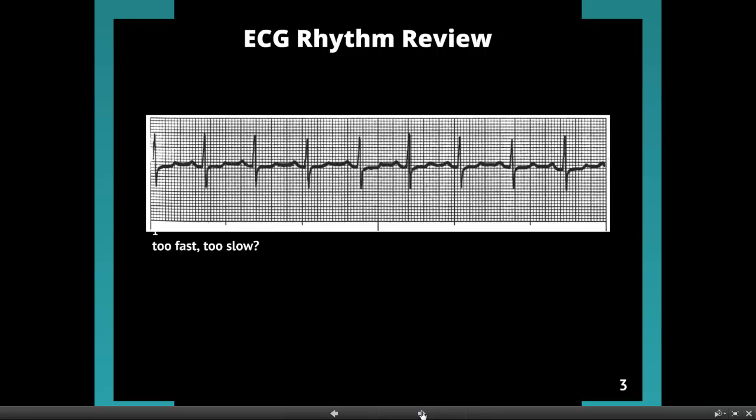Step number one: is it too fast or too slow? We're going to be looking at the QRSs — how far apart are they? These seem to be equally separated. We're going to use our 300 rule. In this one, we go 300, 150, 100, and see that it's just a little bit beyond three boxes. So it's a little bit slower than 100. Let's just put it down at 90 beats per minute.